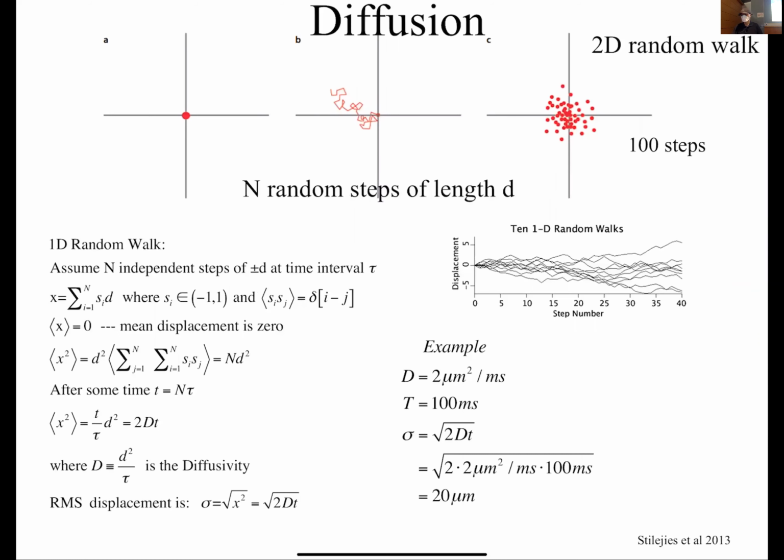And so the first thing we're going to look at is diffusion. Okay? So diffusion, as you know, is just a random motion of, let's say, water, or any sort of particle. The classic example is, if I had a bottle of perfume and it's all concentrated here in some bottle, I open it, then it's going to go from high concentration to low. It's going to preferably try to equalize the concentration of perfume in this room, and so it will diffuse out, and randomly it will get to you, and you will start to smell it. So that's diffusion.